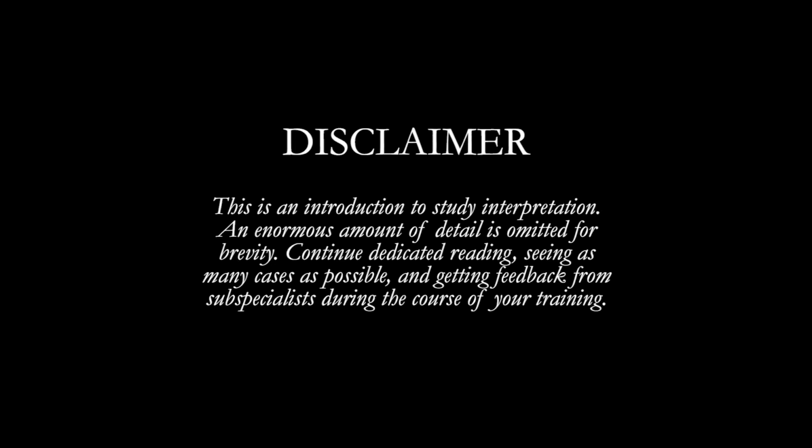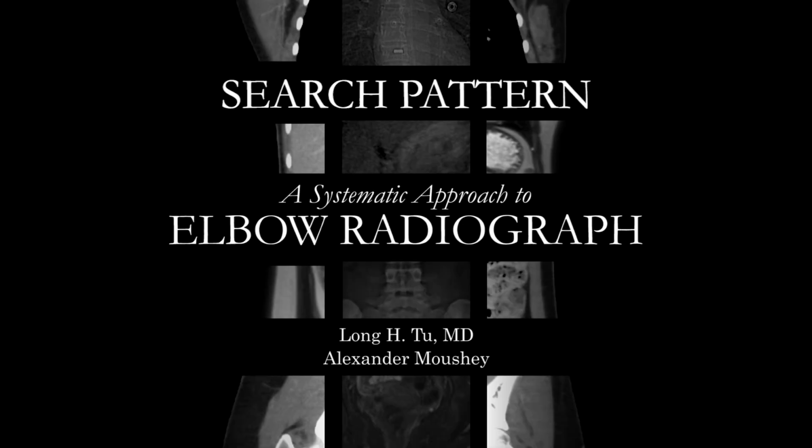Please note that this is an introduction to study interpretation. An enormous amount of detail is omitted for brevity. Continue dedicated reading, seeing as many cases as possible, and keep getting feedback from subspecialists during the course of your training. Okay, so today we're going to talk about a basic approach to the elbow radiograph.